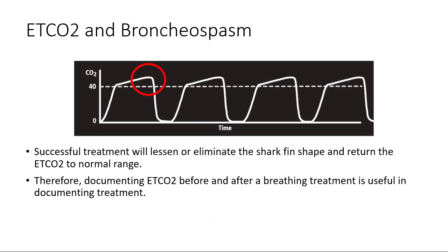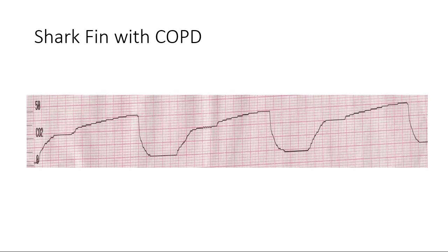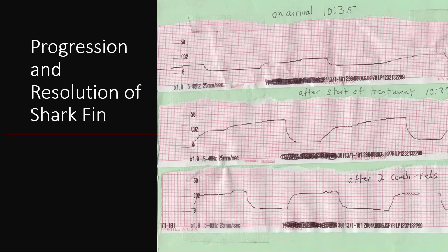So we call this the shark fin. And the nice thing, you look here because it kind of looks like that. The nice thing is that it's great, when your interventions work, such as bronchodilators, it shows that.